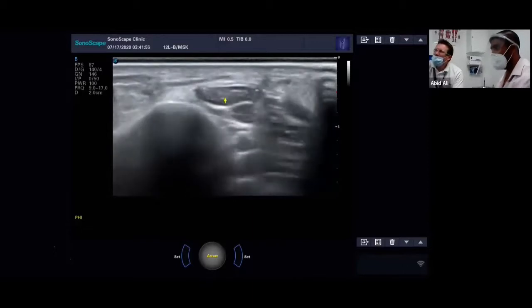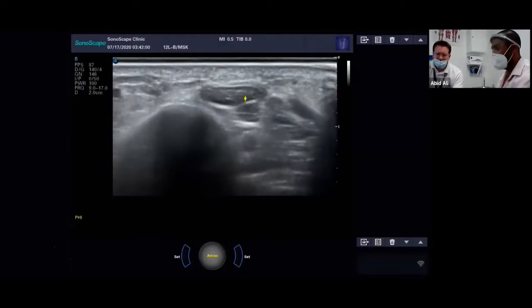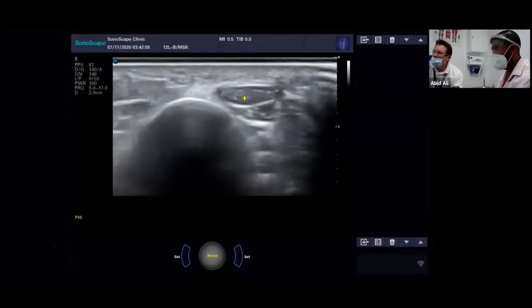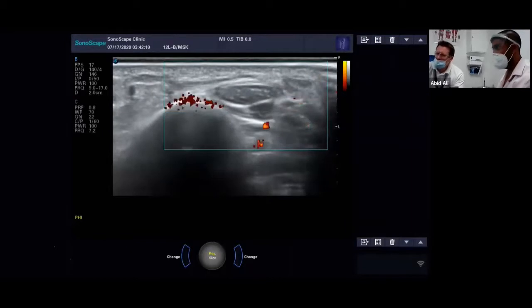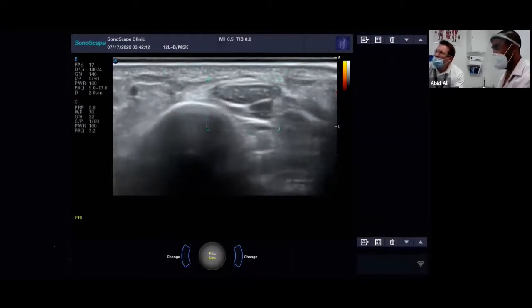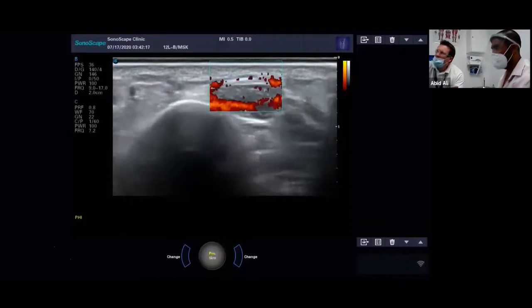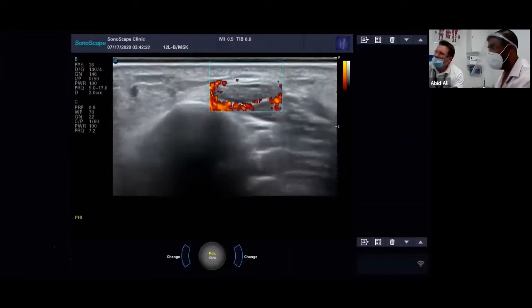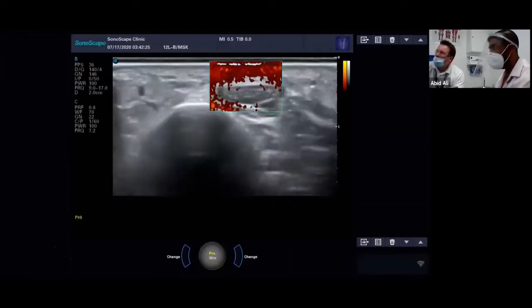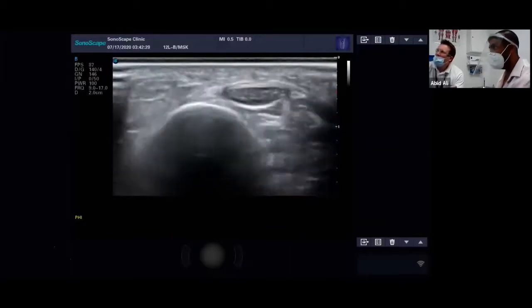Anything more than that is probably a problem. Also at this stage would be interrogating it with the colour as well, to see if there's any inflammatory changes or synovitic changes or paratendinitis. And also we're keeping an eye on the internal structure of the tendon to make sure it doesn't look too thick or too expanded or too many dark patches. We want to see bright echoes from the fibers. We don't want to see any dark patches that could indicate an internal rupture or a tendinosis, degeneration.